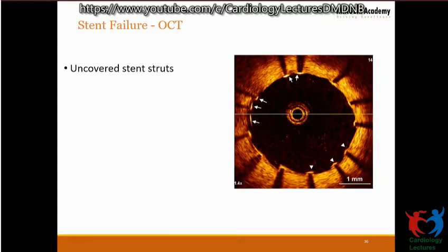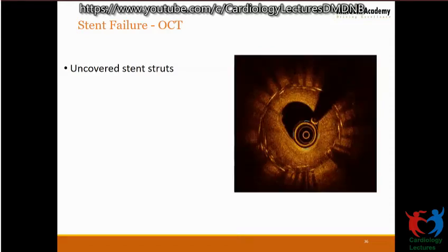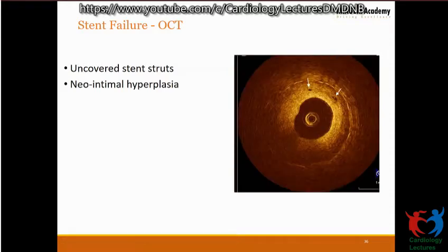So this is a case example of uncovered struts. At the end of 6 or 9 months, these stent struts were uncovered. This is probably because the endothelium did not grow over this. So if you stop the antiplatelets, it can become a nidus for thrombus formation, and the patient can develop stent thrombosis. This picture shows you neointimal hyperplasia, a common thing which happens when you put more than two layers of stent. You can see two layers of stent here, overlapping stent struts, so more chances of restenosis.